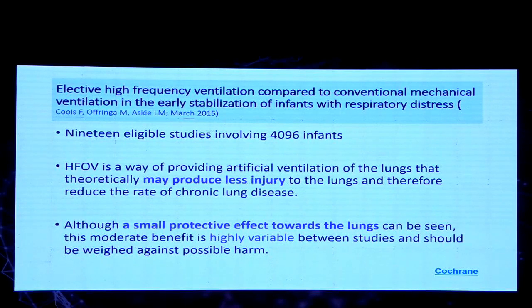The US study used SensorMedics, which is an active piston-driven device with an active expiratory phase as well as inspiratory phase. In the studies done in Europe, mostly they used just regular ventilators that have an added passive high frequency to it. They only used active expiratory machines like SensorMedics as a rescue therapy. The guidelines and protocols were not really established in the European study, whereas they were established in the American study. So again, when you put these together in the meta-analysis, it's not fair, and you just dilute the effect.